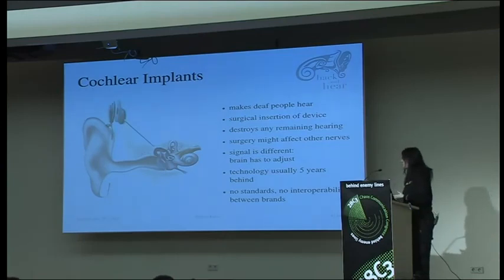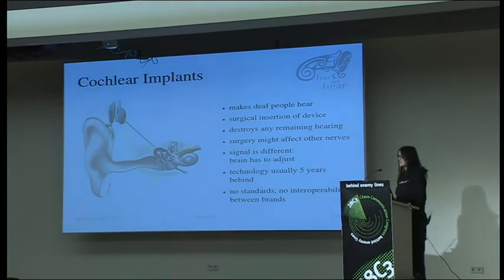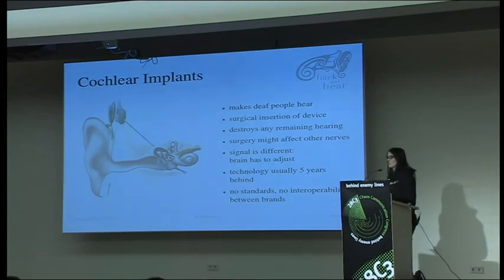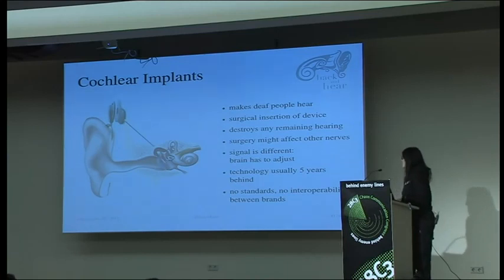And like for the other hearing aids, there are not many standards, no interoperability between the brands. So if you decide you take a cochlear implant of one brand, you can never switch to another one. So you have to think that through.